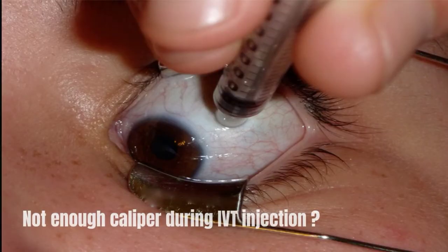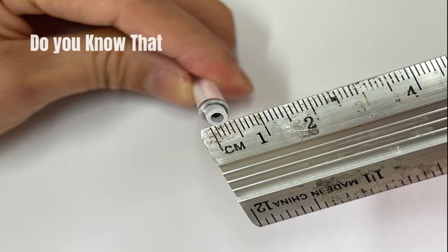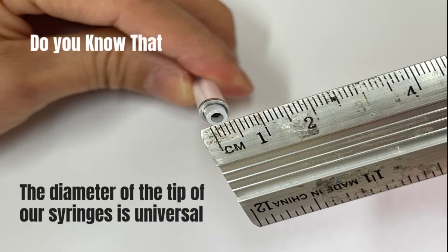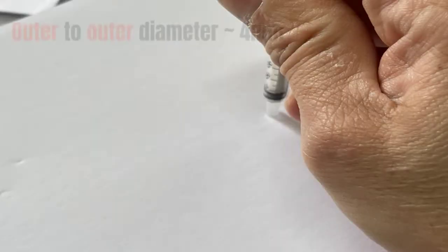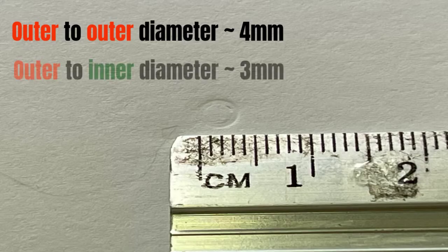Not enough calipers during intravitreal injection? Try a caliper substitute. Did you know that the diameter of the tip of our medically used syringes is universal? The outer diameter to outer diameter is about 4 millimeters, whereby the outer diameter to inner diameter is about 3 millimeters.